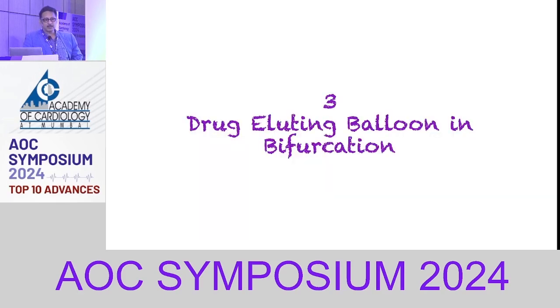Then comes drug-eluting balloons, for which I have found newfound confidence among the European operators. Drug-eluting balloons were introduced somewhere in the mid-2000s, 2005. They first came on the scene approximately at that time. And at that time, with the drug-coated balloons, the drug concentrations and the deliverability, I would say, there was so much drug on the balloon that there was no consensus on what the approach should be. And it was only paclitaxel.